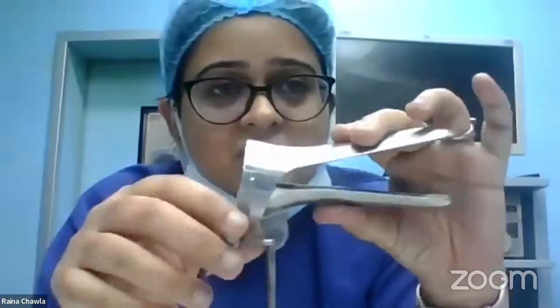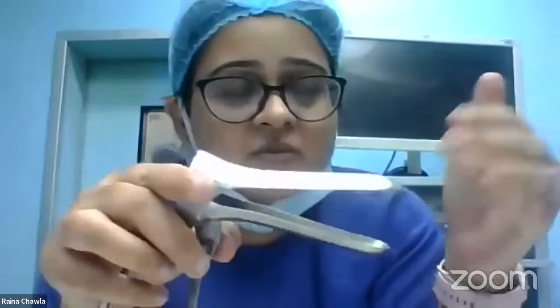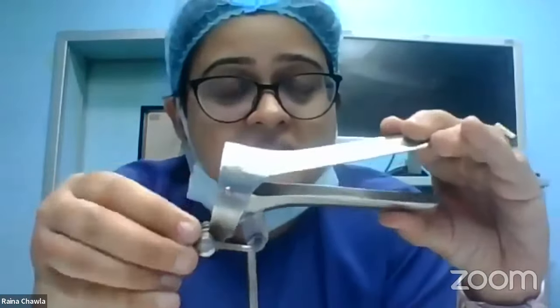Another advantage of Cusco's is if there is a sick patient, or an immobile patient, or a patient who can't come to the edge of the bed. This can be used even when the patient is in the middle of the bed. You don't have to bring her to the edge of the bed and put her in a dorsal position or a lithotomy position to examine. This can be done comfortably when the patient is in the middle of the bed. These are the advantages.